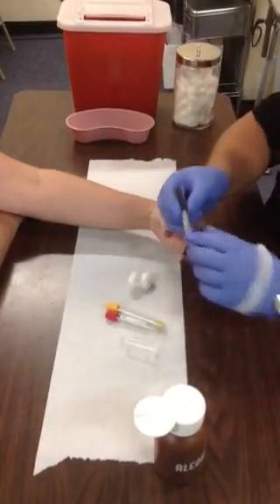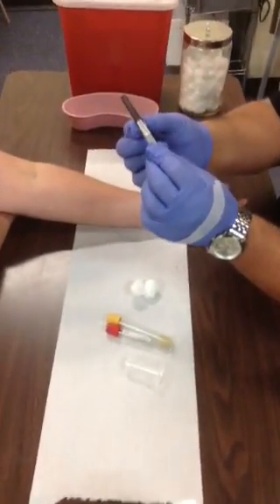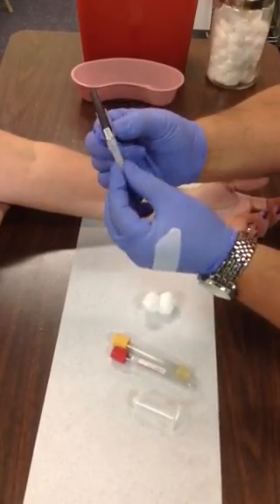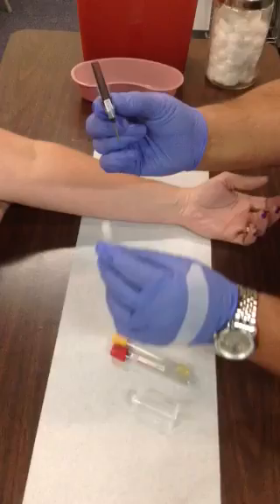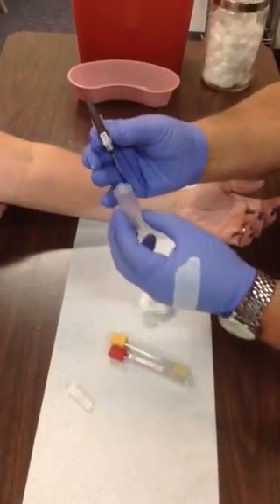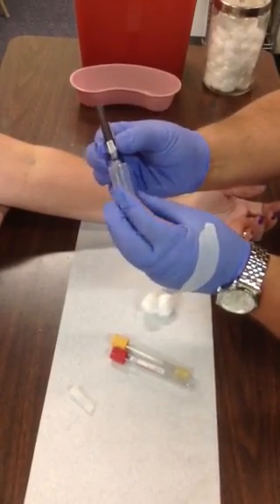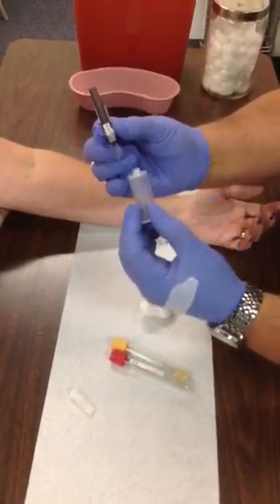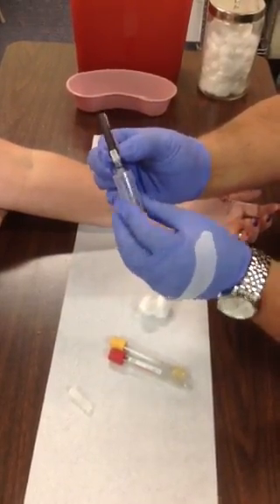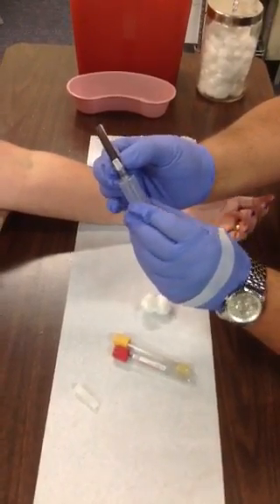While that's drying, go ahead and assemble your supplies. Take the vacutainer needle and hold it at the base of the pink safety adapter, then twist the bottom cap off — you'll see that seal break — and pull it away. Remember, underneath there is a needle so don't touch that. Place the male side of the needle into the luer of the adapter. Make sure it's nice and firm because you don't want it to slip off as you're getting ready to draw blood.